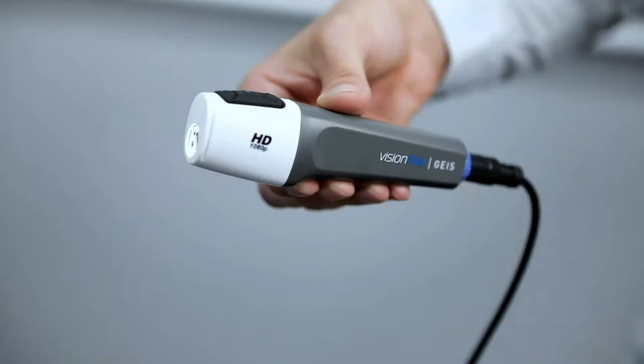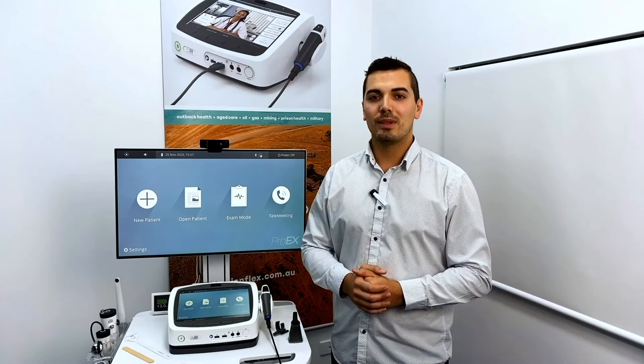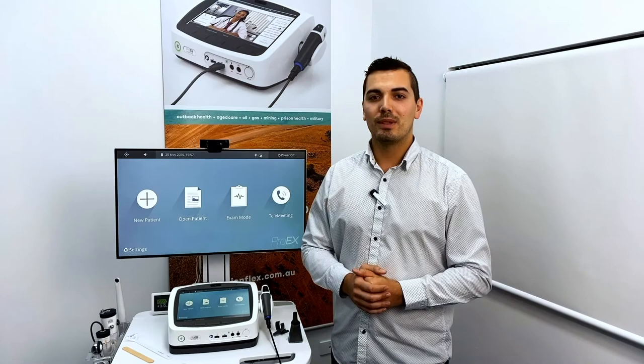For cleaning the GEIS camera, standard hospital grade cleaning wipes are recommended. Please note the GEIS camera is not intended to come into contact with the patient. Please refer to the user manual and visionflex.com.au for more information.